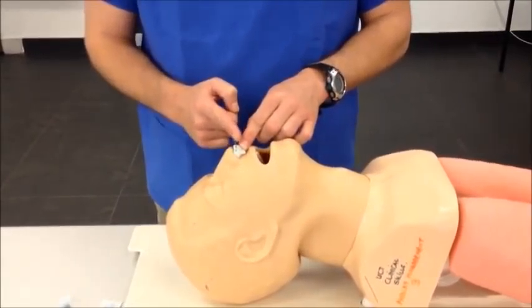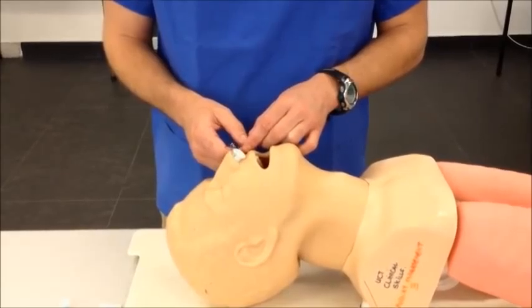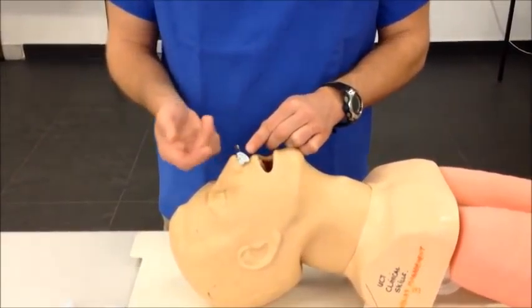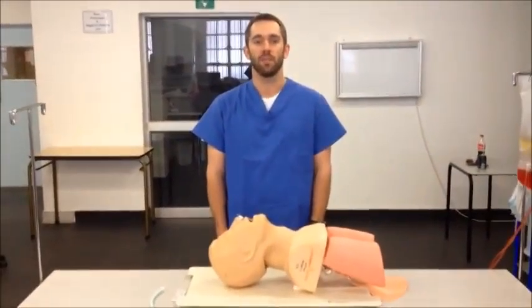It's important to note that loss of airway or migration into the nasopharynx is a real concern and a possible complication, and inserting a safety pin like that or using an alternative device is a necessary safety precaution. And that's it, correct insertion of a nasopharyngeal airway.